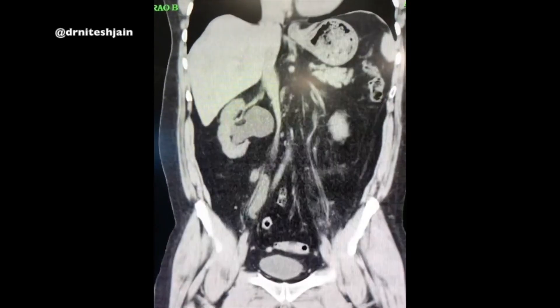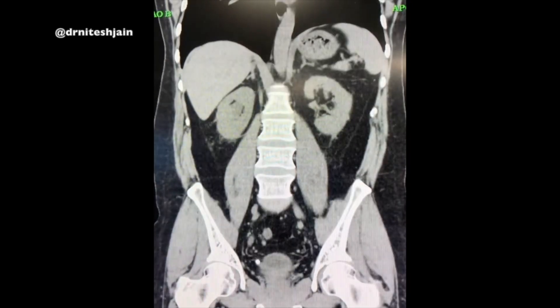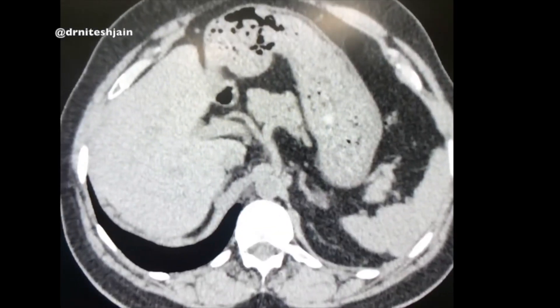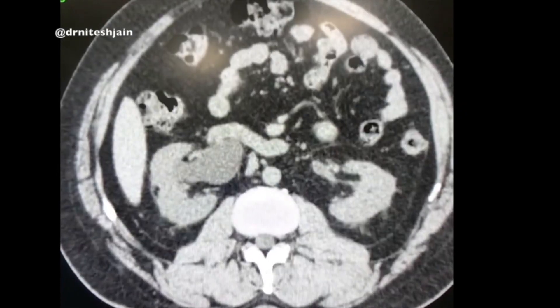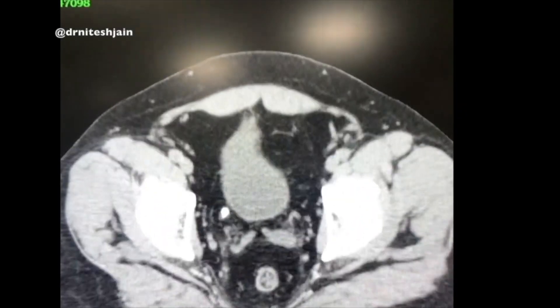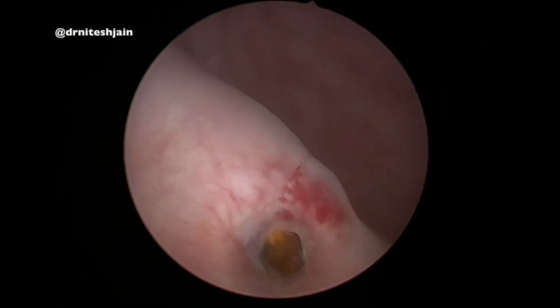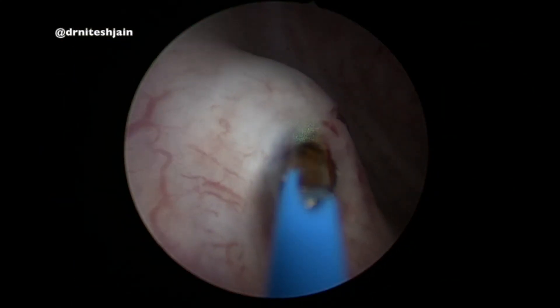Here we have a young male patient who presented to us with right flank pain. On plain CT, a 1 cm stone was seen in the lower ureter. On cut section, it was confirmed to be very near to the VUJ. Cystoscopy was done, and the stone was seen protruding out of the VUJ.